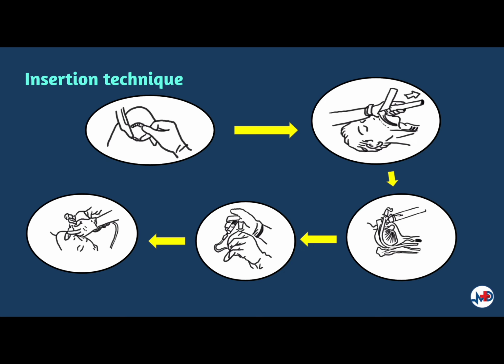Remove the stylet in the endotracheal tube and the laryngoscope and inflate the cuff of the tube with 10 mL of air using a syringe. Attach the endotracheal tube to the ventilator circuit and ventilate with high concentration oxygen. Observe for chest expansion and auscultate to confirm positioning. Secure the endotracheal tube in place with a twill tape ribbon.